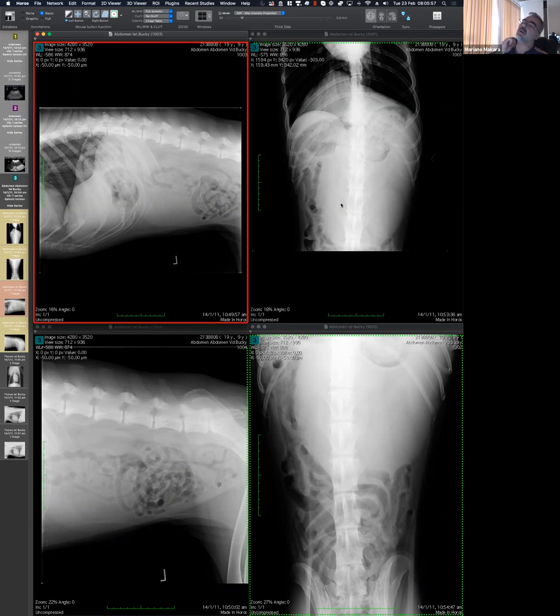Okay, so it seems that you are going back and forth between two ideas. On one side is the idea of a mass effect, and the explanation for that is that there is displacement, but you are uncertain if that is the case or if there is fluid. I would assume that you are saying one or the other means fluid without mass effect. Is that correct?